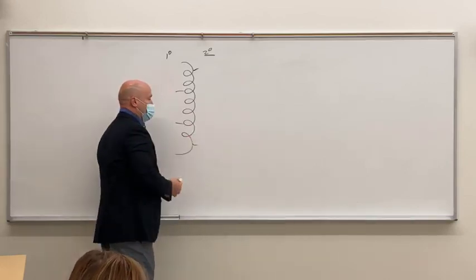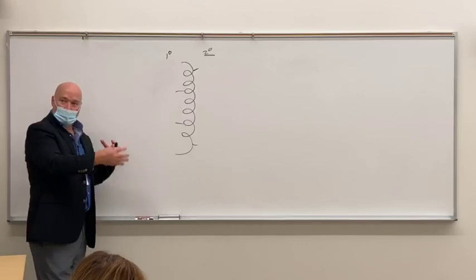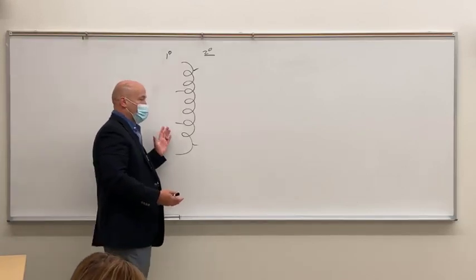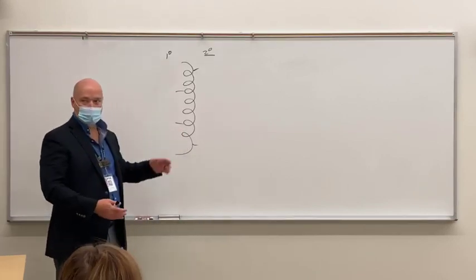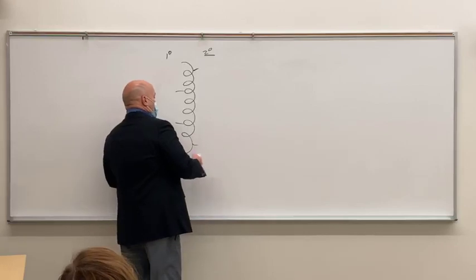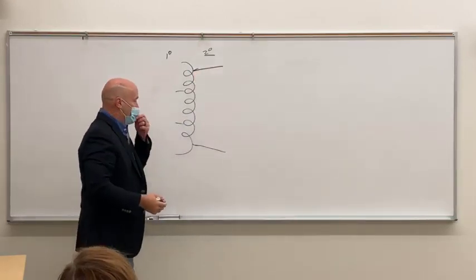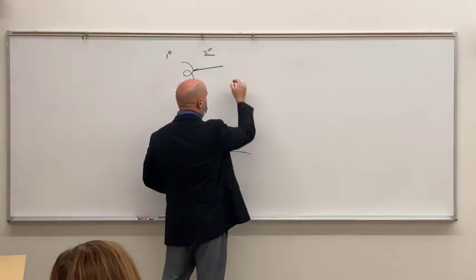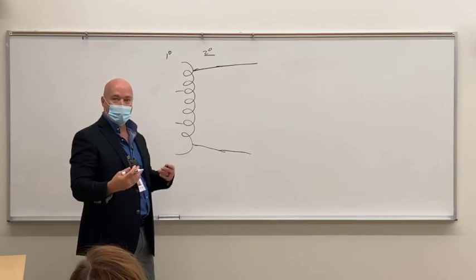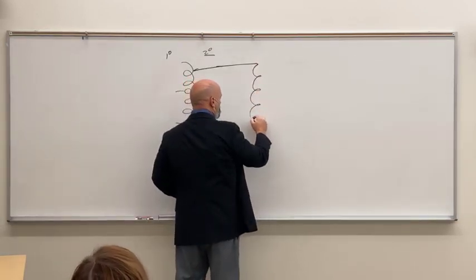Do you have kilovoltage at this point? No. This is a voltage manipulation for safety, for your sake. We use relatively low voltage. If we have kilovoltage at this point, it'd be much more dangerous. So coming out of the secondary side of that, this is our KVP selector, but we don't have KVP yet. We said that we're going to put as much as we can in the low voltage section for safety. All right, so it comes out of that and it goes into a transformer.